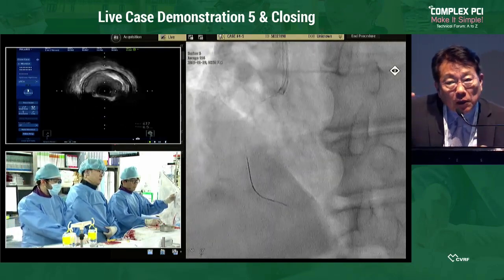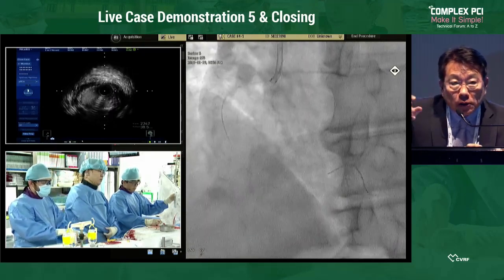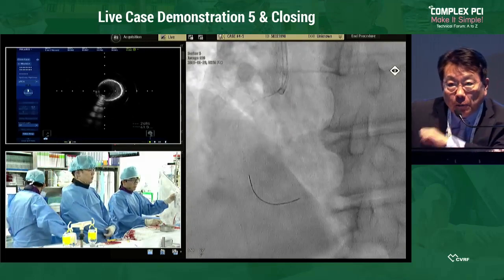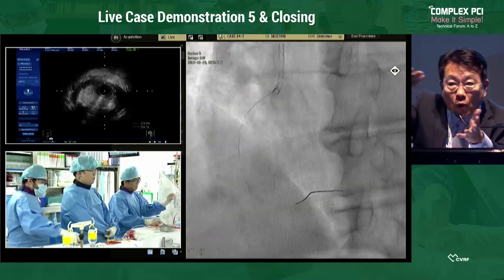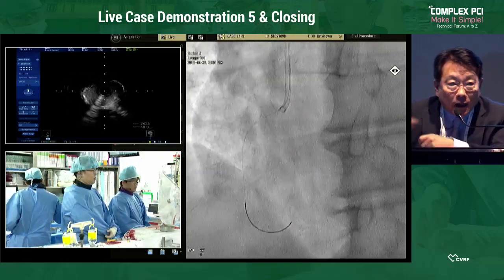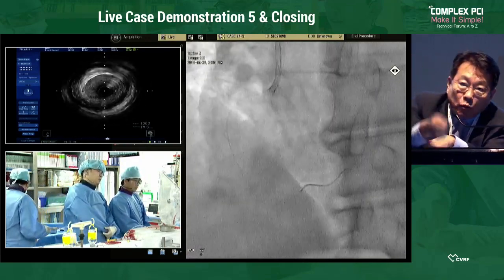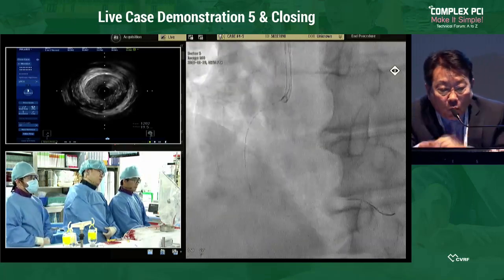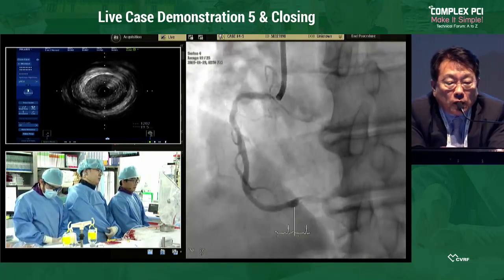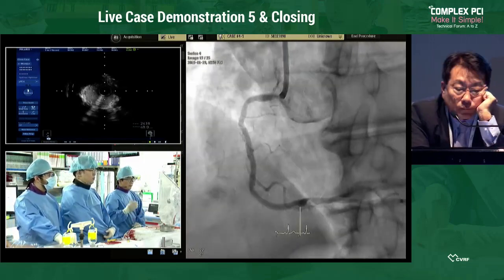However, there is a stability concern: the right coronary artery is unstable, with not too much support. The wire is very important. A far distal impact of the wire can make the whole system stable, right? With the wire inside and the guider floating outside the ostium, we can still work some part. That is the most important part about an ostial, unstable right coronary guider, right? Good. Yes, right. So I fully agree.